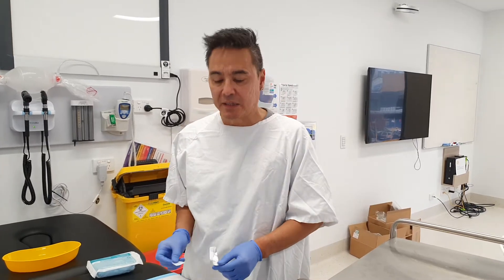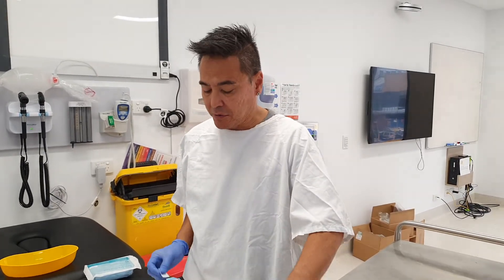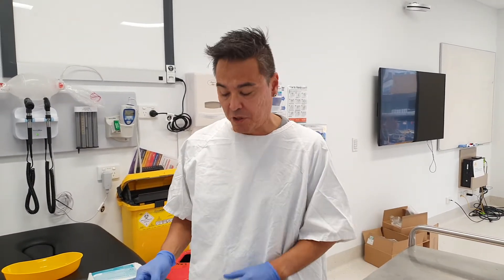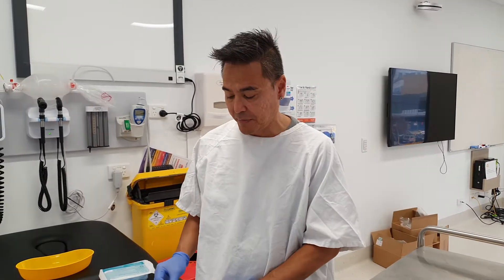I just wanted to give you a demo on blood cultures. I've seen them done really badly. I've been pretty successful with my blood cultures and I just wanted to share with you how I do them and how I've taught my medical students how to do them.